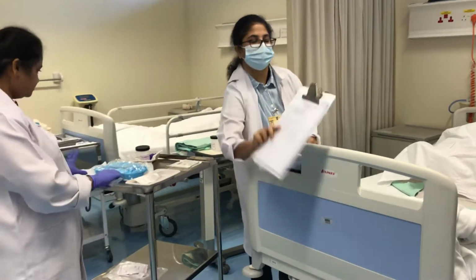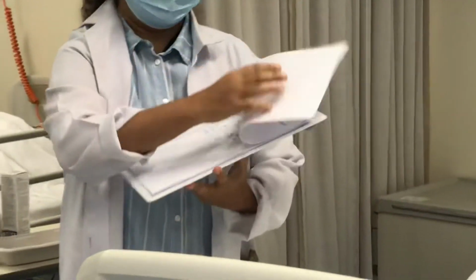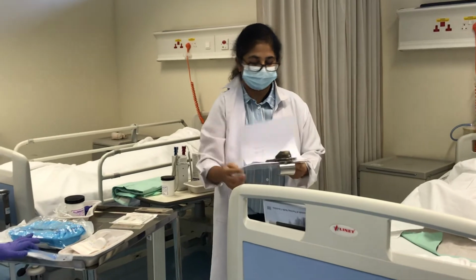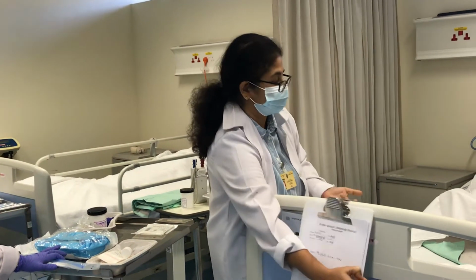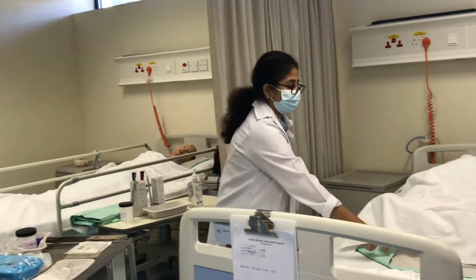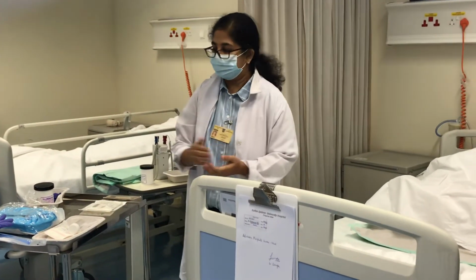So another important thing we are assessing is the intake and output of the patient. The output we need to measure, as well as here our situation is the patient is having continuous urinary incontinence. So that is the intention of today's procedure. So let's see the articles.